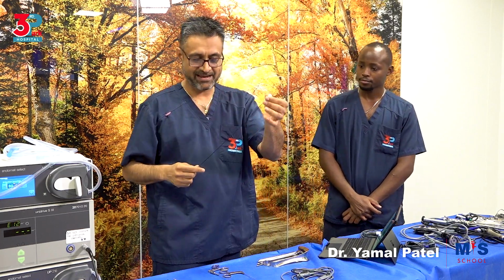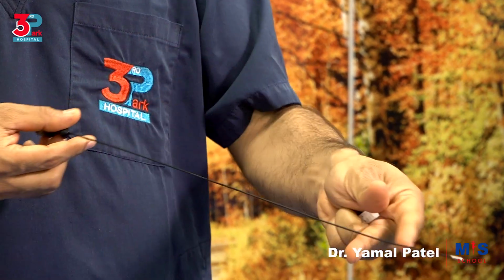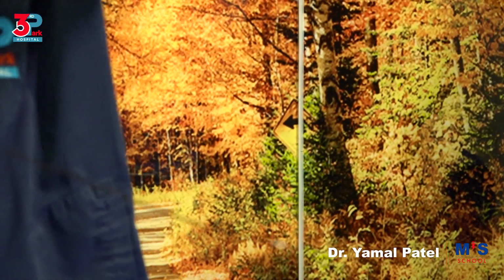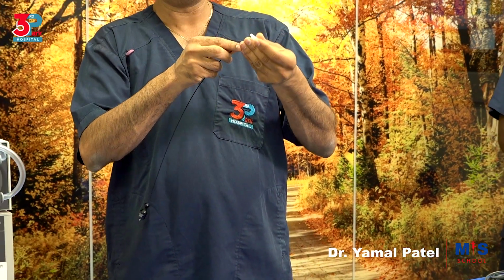It's an energy instrument where you can see there is a small needle at the top and you connect it to the bipolar here, and using this you will be able to cut through adhesions or do a metroplasty, lateral metroplasty or a fundal.